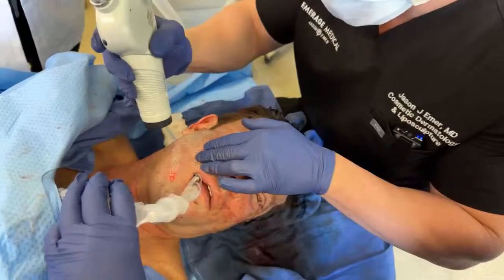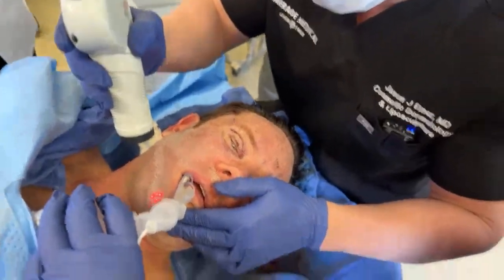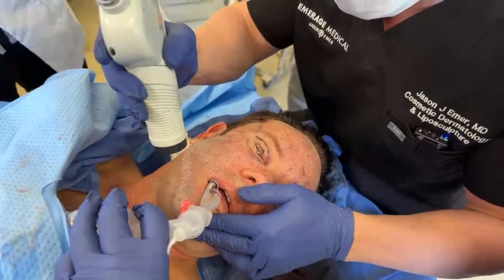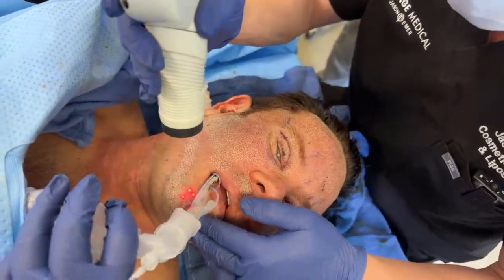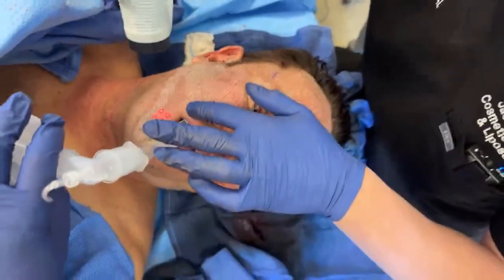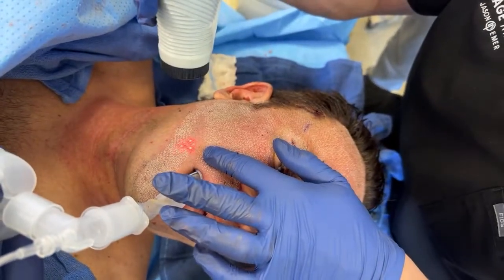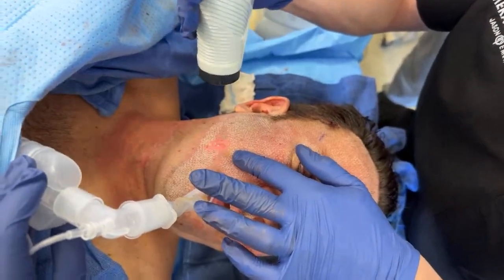So it's very important to be very meticulous in how you place this. Also, just for people who understand lasers or don't understand lasers, the jawline below, there's a dramatic change in the thickness of the dermis, so it's very important to change your settings or do a different type of approach from the neck jawline below.